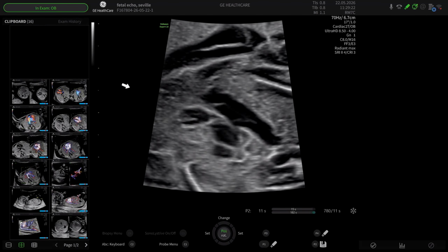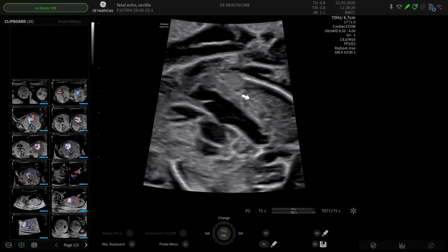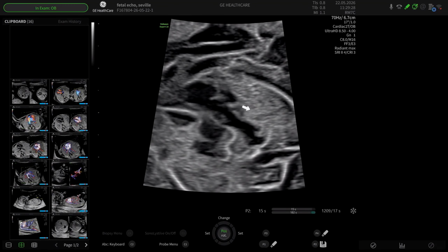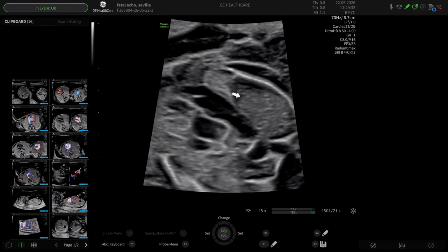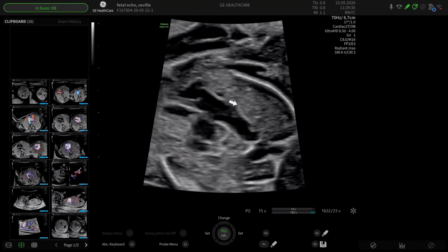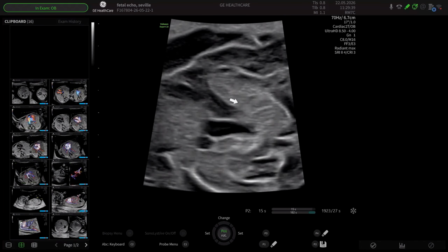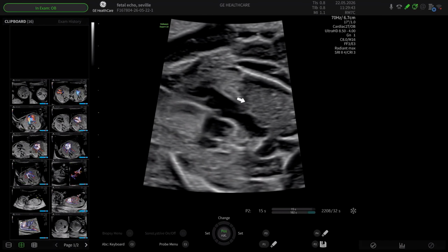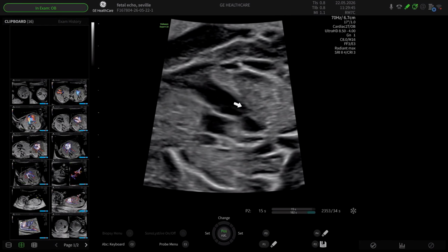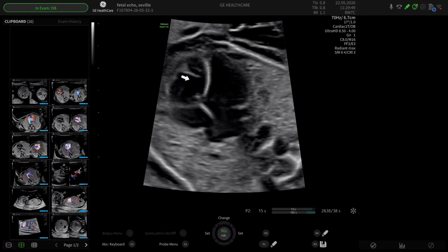If you feel that the coronary sinus is prominent, look beside the pulmonary artery. There should never be a vessel beside the pulmonary artery, and that's the clue of either a persistent left SVC or an ascending vein of a total anomalous pulmonary venous return. Sometimes you can catch the atrial appendage on the left-hand side that can mimic the appearance of an extra vessel, and to prove that it's not, just go a little bit higher to get it out of view.